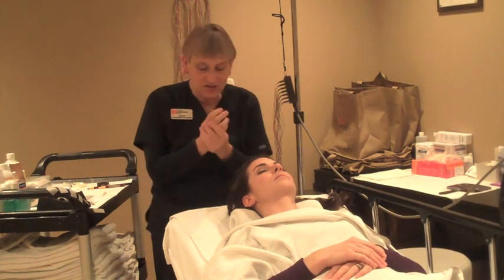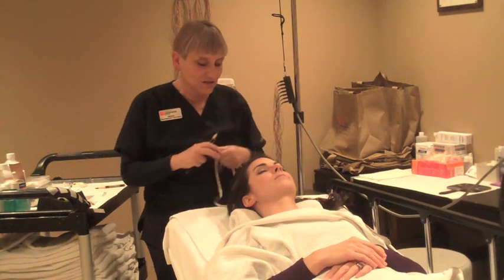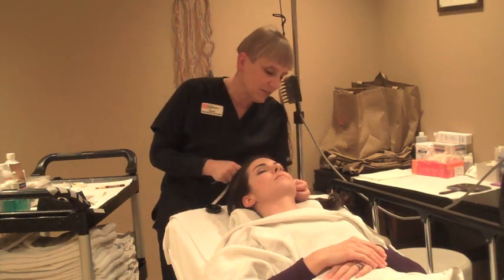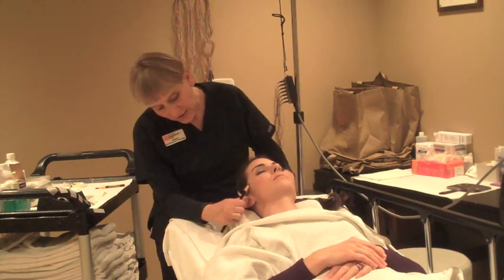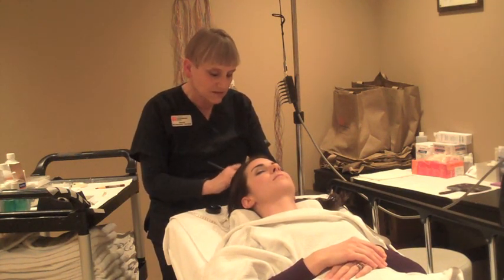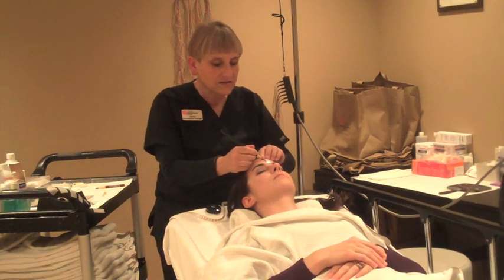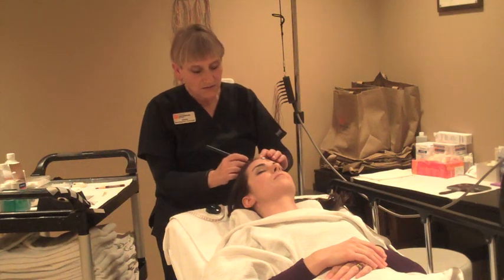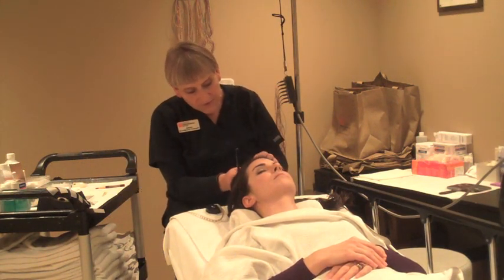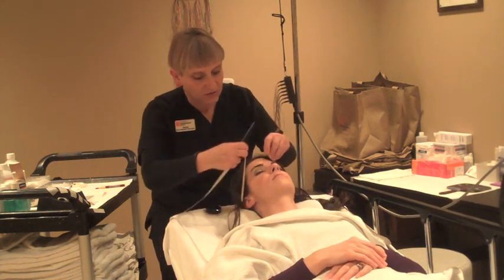The first thing I'm doing is just washing my hands, and then I'm going to measure your head. Every patient has a little bit different size and shape, and these electrodes are going to be placed on your head according to an international system of measurements. So if your record is read by any other physician, they can look at those electrode designations and know exactly what part of your head they're on. Everybody's a little different size and shape, so the wires are placed according to your head size.